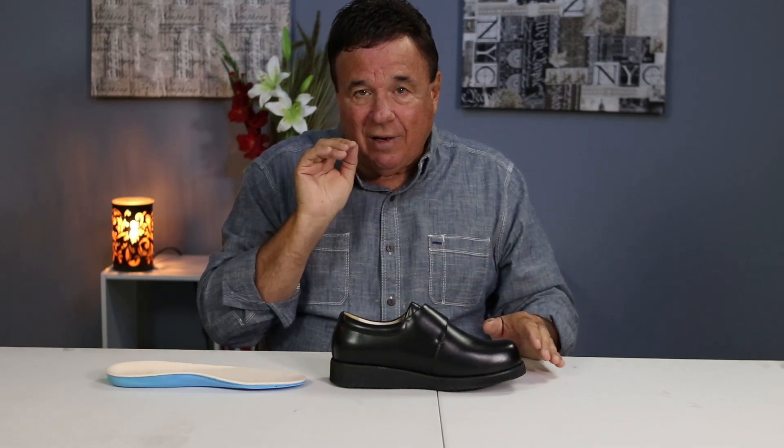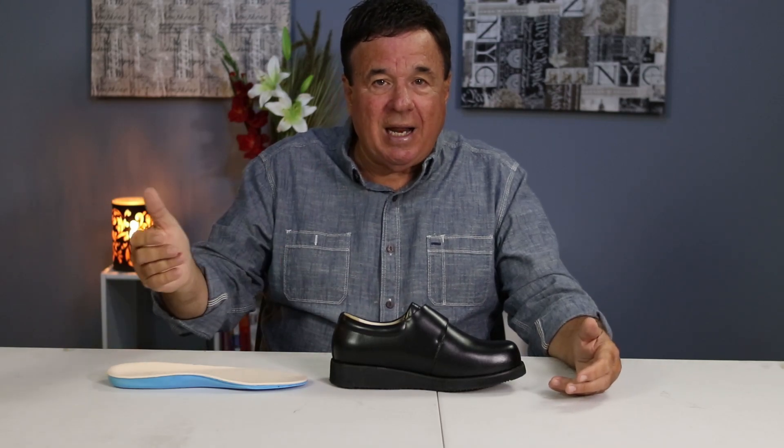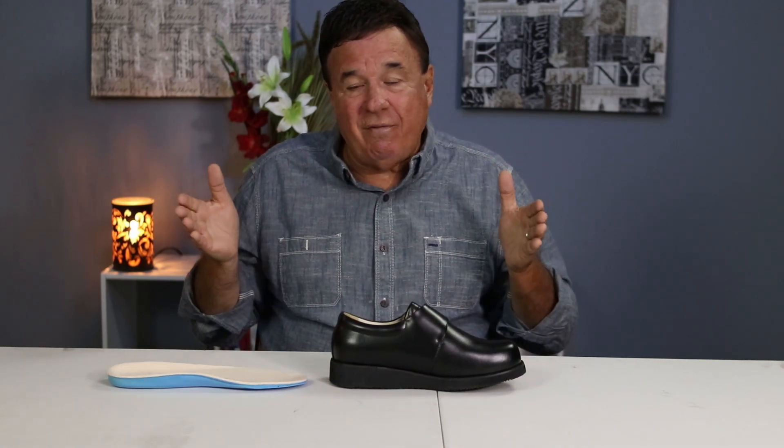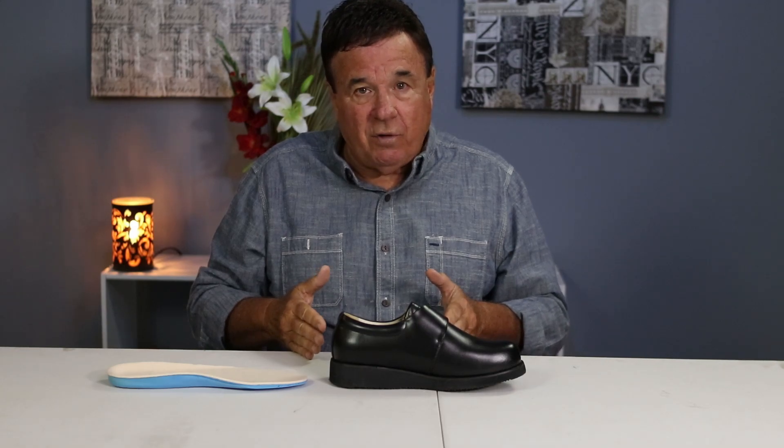You have a four-flex like you do in every footwear, but all comfort shoes and all comfort athletic have a bilateral movement. So if you walk five miles, you put about eight to eight and a half miles of additional wear and tear on your foot. In our shoes, if you go five miles, you get no more than five miles of wear and tear on your foot.